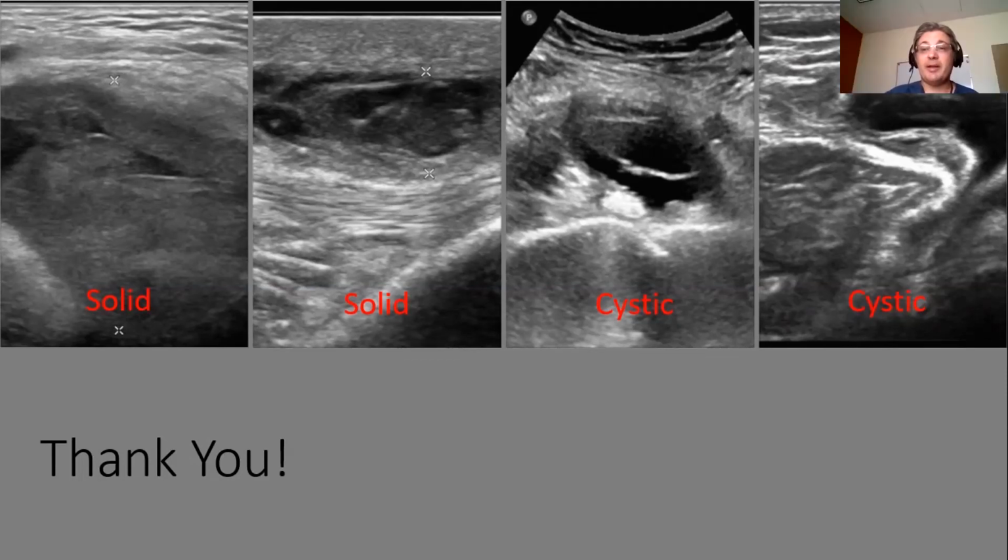What's great about these anterior knee bursas that we spent a lot of time talking about is that they're all very, very superficial, and oftentimes you don't even need image guidance. Where image guidance is very helpful, specifically with ultrasound, is if you have a bursa that has different components. Let's say an area that's more solid due to synovitis and an area that's more simple appearing and composed of fluid. Certainly you'd want to put your needle in an area that is more fluid-like so that you can actually aspirate something if you're doing it for a diagnostic purpose.